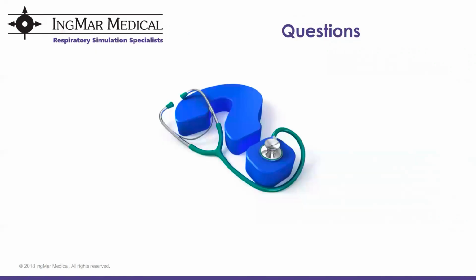So we do have another question. Still related to the vital signs monitor. The vital signs monitor is normally an extended screen, but can it be projected over Wi-Fi? We have just now started using them. I really like your product.